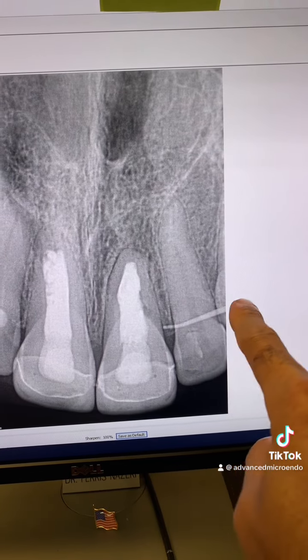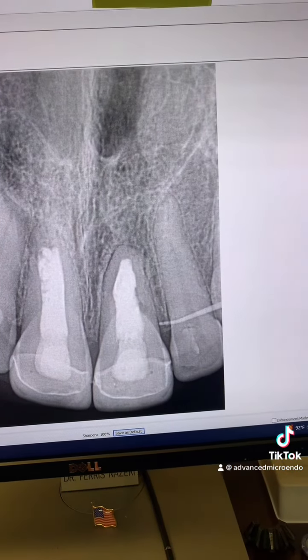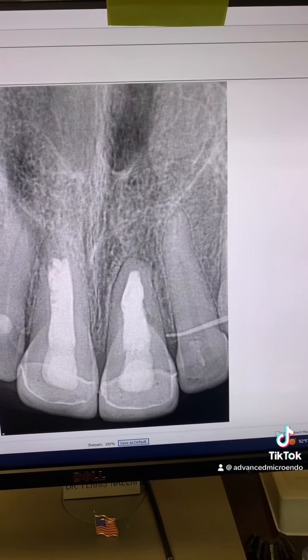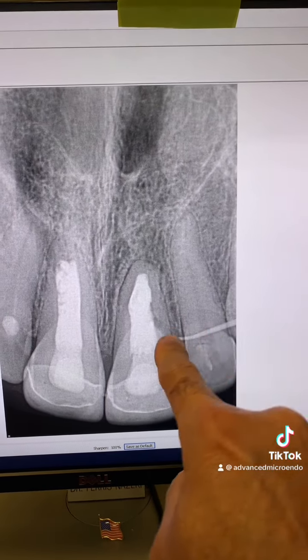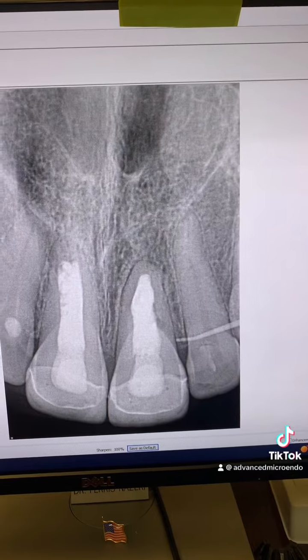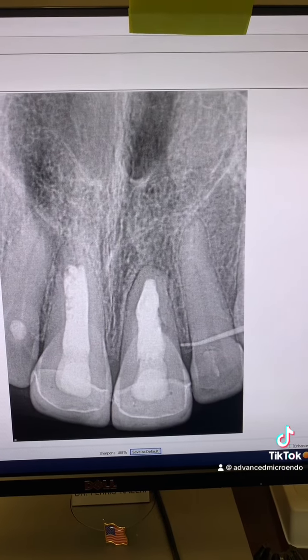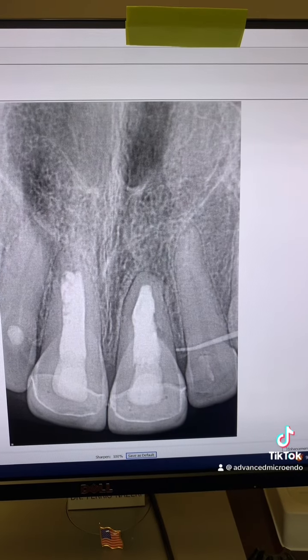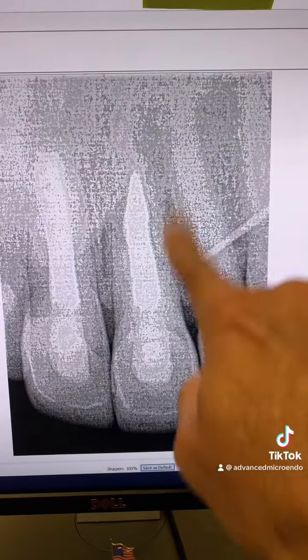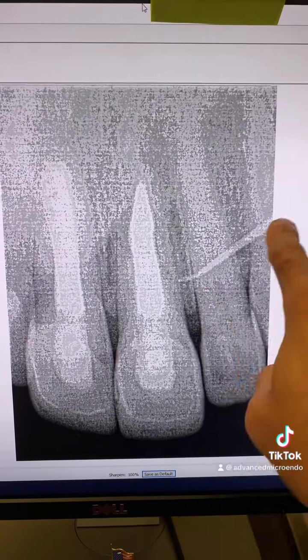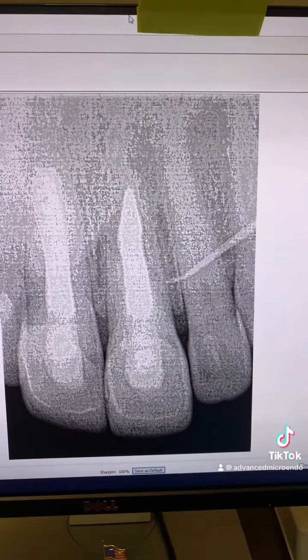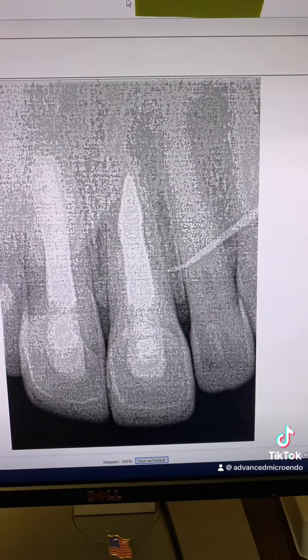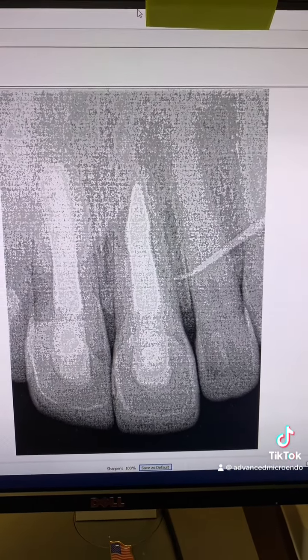We went ahead and traced it, and you can see it's going to exactly where we thought the problem was. My gutta-percha tracer is going to that location right there — that sinus tract is draining this area here. And from another angulation, you can see where that tracer is going: to where the inflammatory root resorption and secondary infection is, because of the presence of microorganisms.